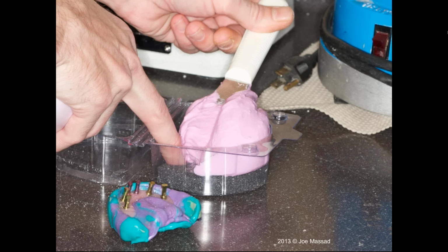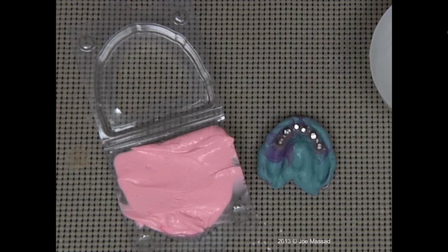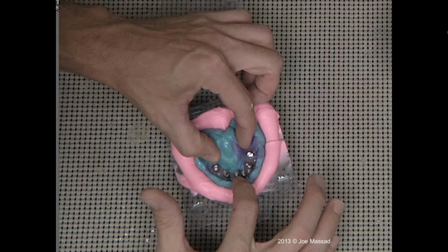Now you'll see I have the alginate all the way to the top of the tray, and now we're going to cut the handle off of the impression tray, which we did. And I'm going to push the impression all the way down to the height of the peripheral border. Might be a little blurry, but I want to give you a close-up here. You can see this here.